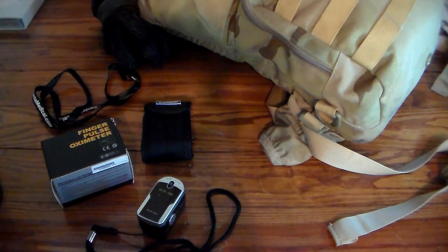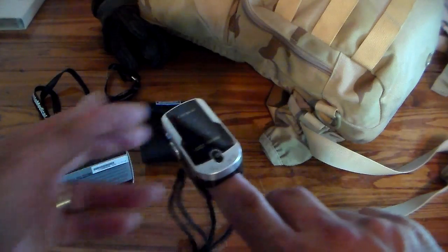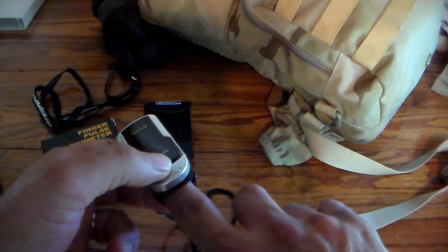You have to make sure if you're using it on someone they don't have fake nails, and typically no nail polish — red especially. Red nail polish will throw the results off. Also, if someone has dark skin it could skew the score a little bit, and do not use it in bright light. Find some shade and have the person sit still.